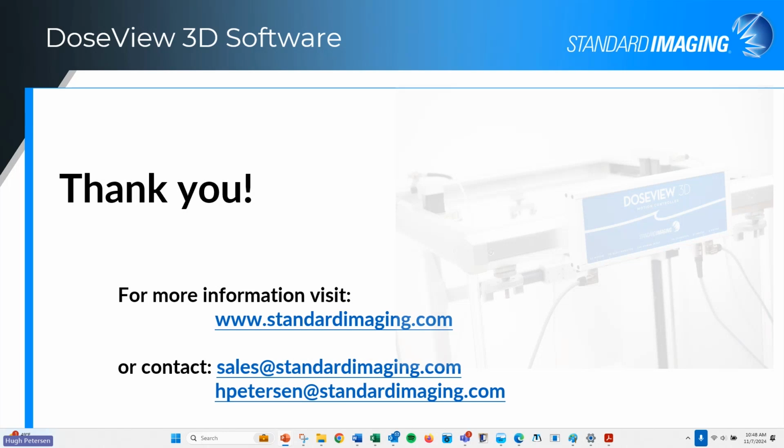So optimize your scanning queue to save time. Basically, and I'm not sure what you mean by optimize, but being able to copy, edit and paste your scans, you can make a single one and then build off of those. The detector orientation does not matter. The detector holder can hold, and you can mount either vertical or horizontal detectors. So the orientation does not matter. It's more a matter of the detector itself.